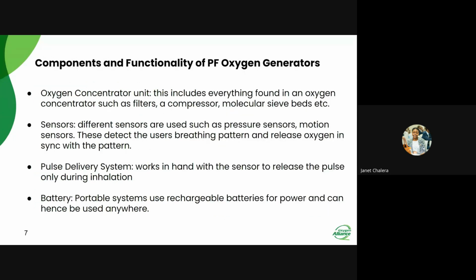So what are the components of oxygen generators? As I've already explained, these pulse flow oxygen generators actually have a concentrator unit. So everything that is found in an oxygen concentrator is found in these oxygen generators.